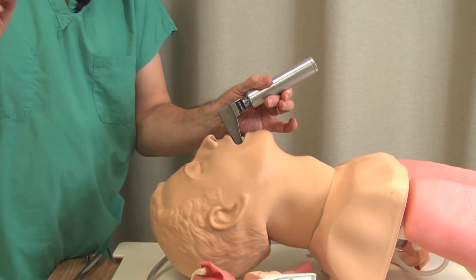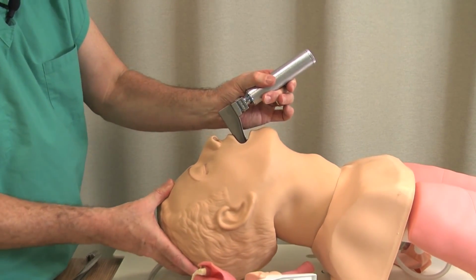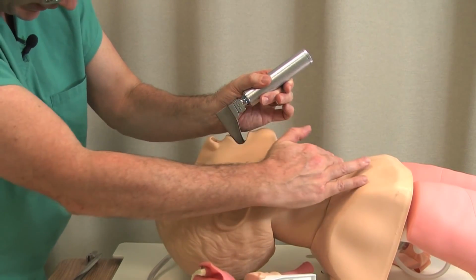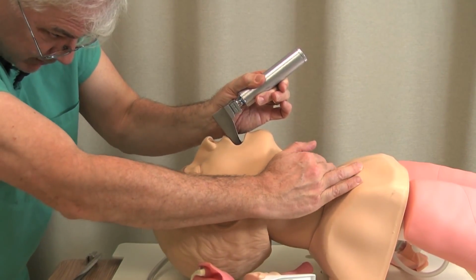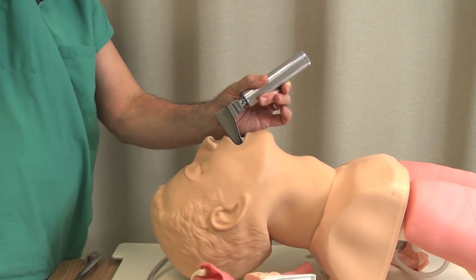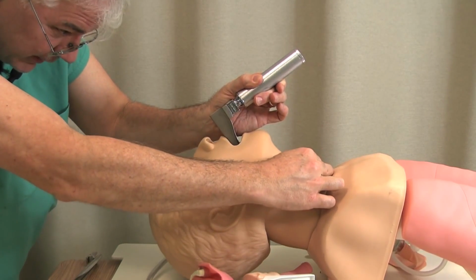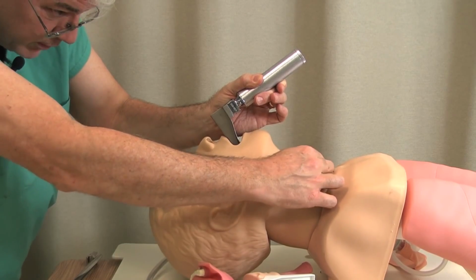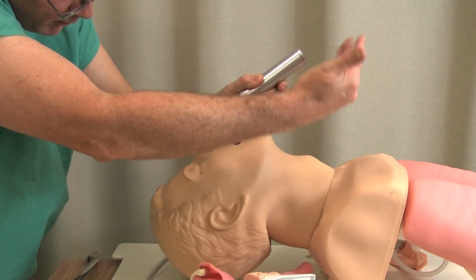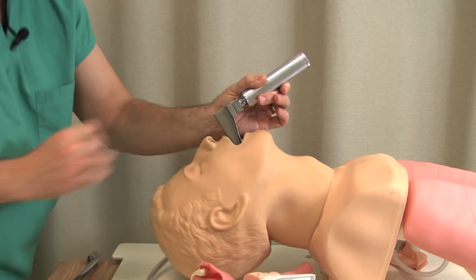I'm going to do one last trick for helping you out. Actually, two last tricks. Let's say I can't quite get the view. Sometimes this helps. You reach up with your right hand and you push down. A lot of times this will bring the cords into view. The cords will tend to run away anteriorly, and sometimes you can reach and push down and get them into view. When you do that, obviously you're going to reach away to get the endotracheal tube. That's when you ask someone, hey, come over here, put your hand just like this, and that will allow you to put it in.